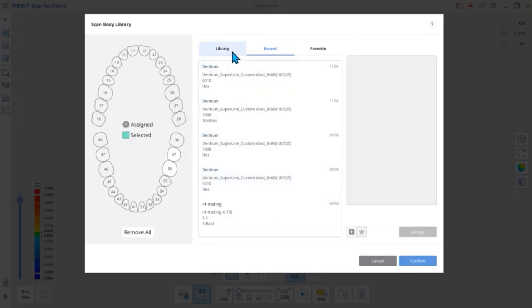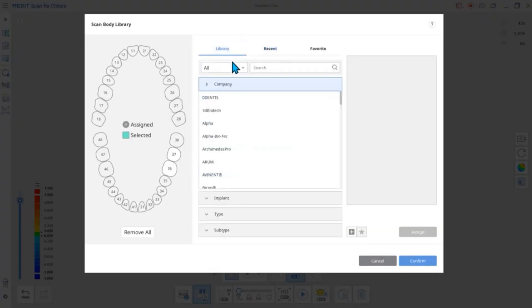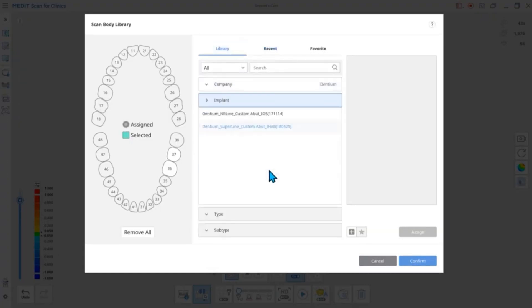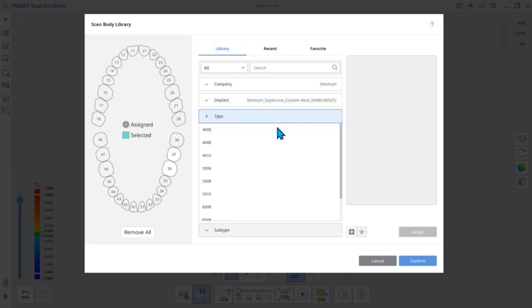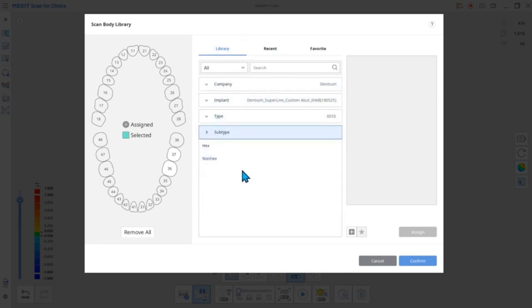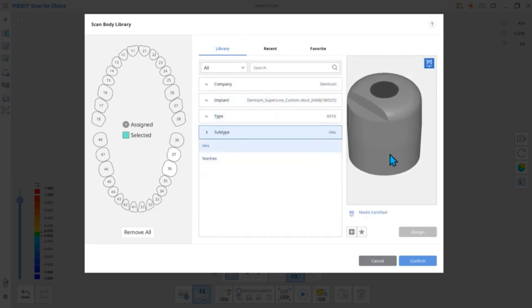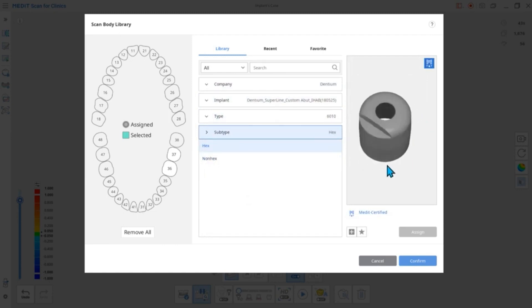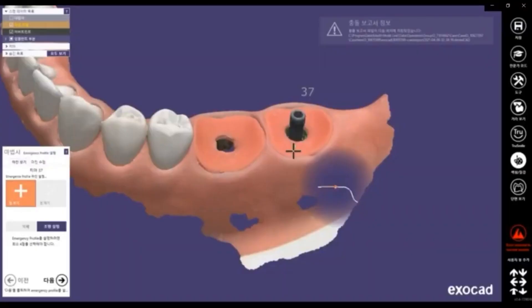Here, you can see the various types of scan body libraries. The scan body data is registered into different files — we will be calling each data file a library. This library will display the implant fixture's location and angles inside the mouth when designing prostheses in CAD software. You can think of it as similar to impression coping in the analog method.